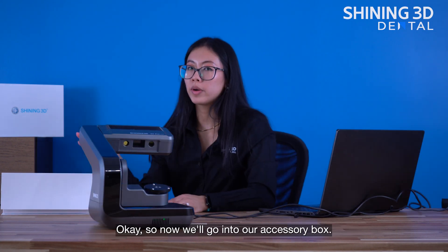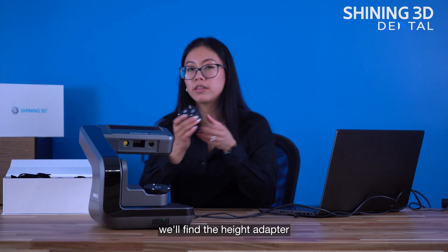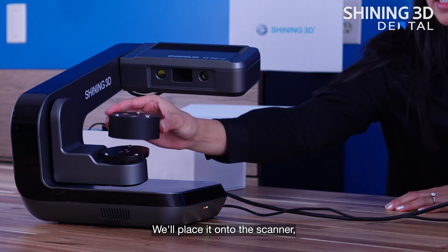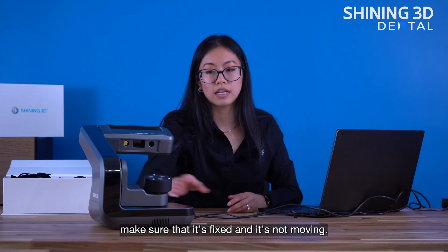Now we'll go into our accessory box, and once we open it, we'll find the height adapter, which is the first step that we should do. We'll place it onto the scanner and make sure that it's fixed and it's not moving.